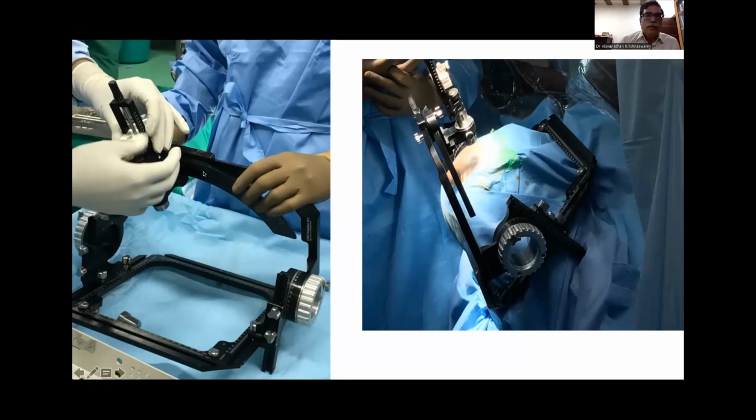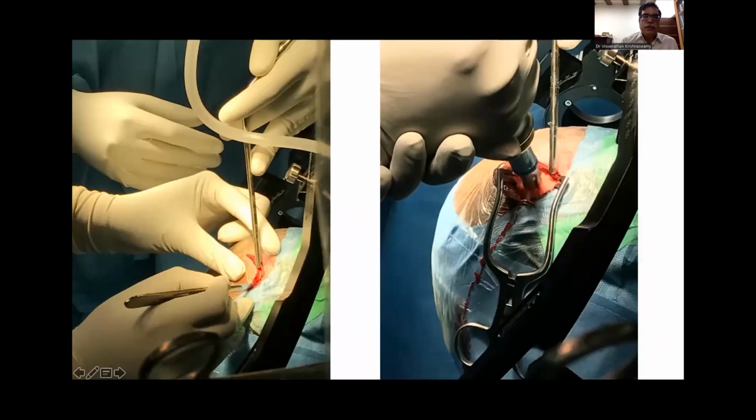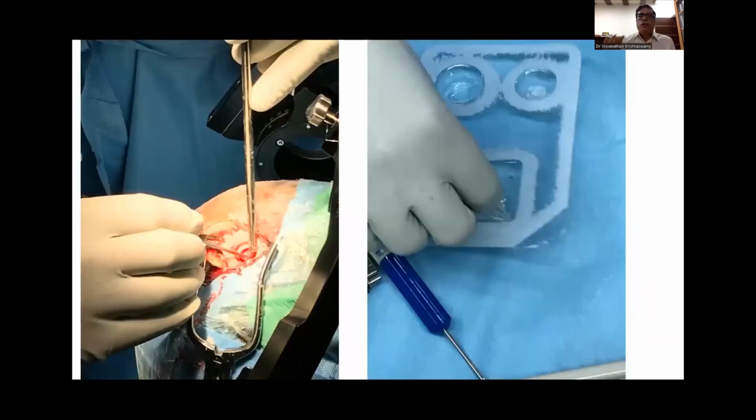Now, what you see here is the MER holder that is assembled, and then the procedure starts with an incision, and then a burr hole is placed. And then we put in what are called stim locks. So these are stim lock bases. These are plastic bases which are screwed in, so that the final electrode, when it is placed, can be held in place with the stim lock of the Medtronic. Each company has its own version of the electrode holder.